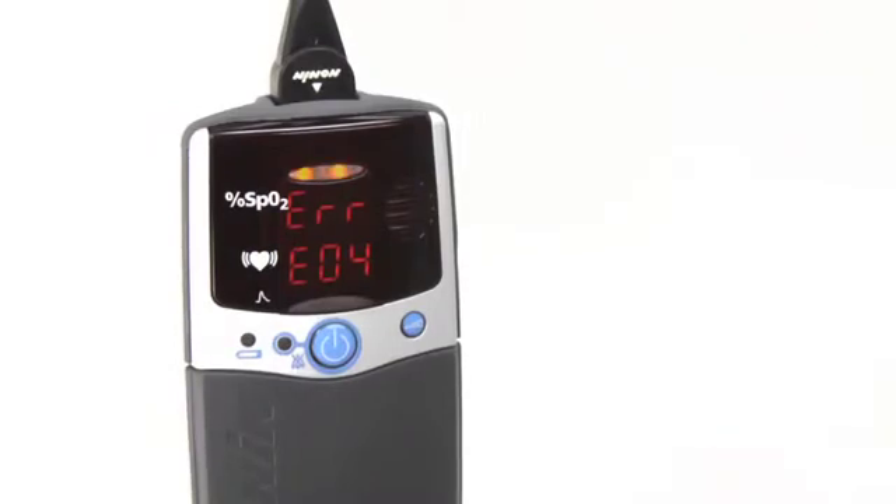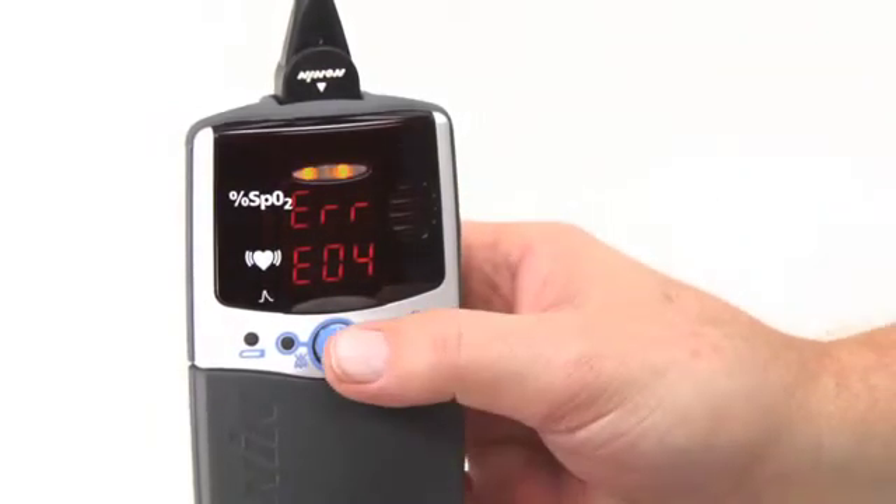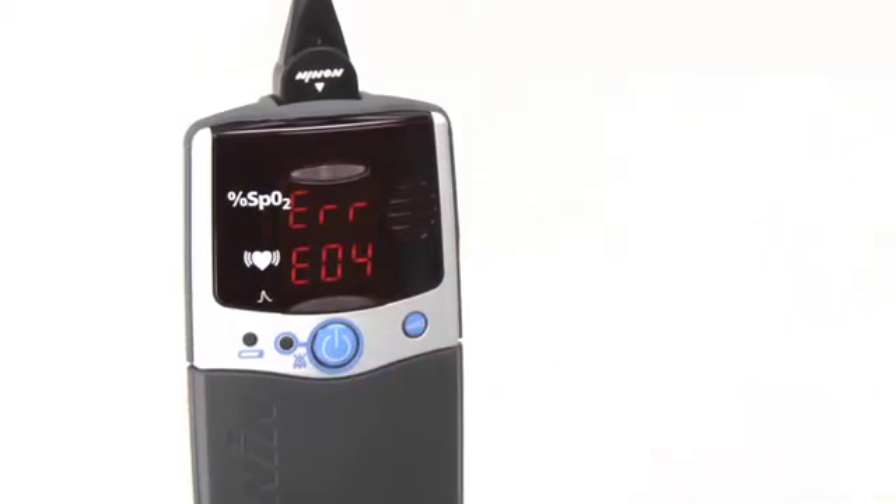Other alarms may occur on the oximeter. You can silence the audible alarm with the on/off button. Immediately notify your clinician or technical support contact.